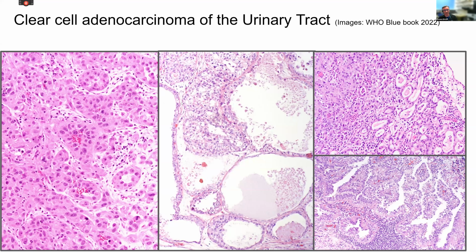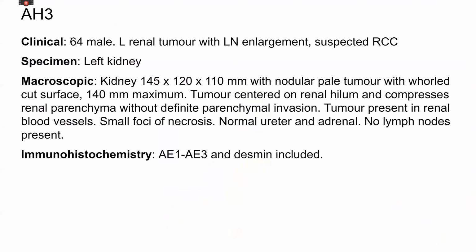I've never seen it in the bladder, but it tends to be the urethra. But again, we can't score this one because it's sort of administrative error more than anything. So there were some questions asking about, can we not score it, combining RCC, chromophobe, and metastatic tumor, because it was added late probably? It's not really fair, because some people have obviously not seen a particular diagnosis. So we can't really do it. It would score obviously on 1 and 2, but it's not fair, I should imagine.